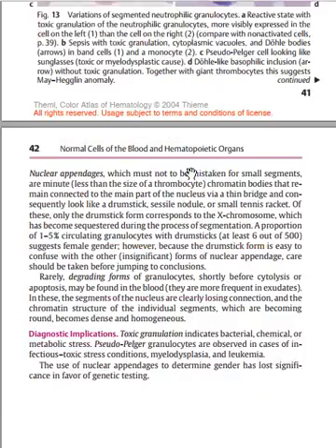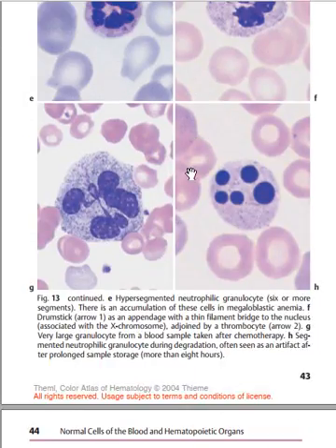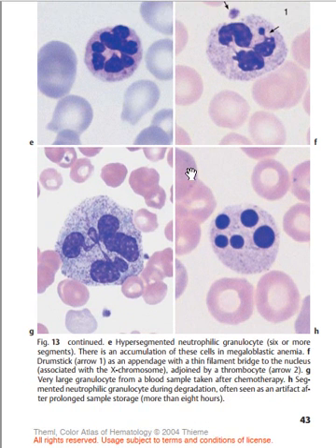Is it clear? Now in this next diagram, we are going to visualize still the clinical correlations of neutrophils. Here you're going to see hypersegmented neutrophils. Is it clear? It has 6 or more segments. So it can be seen in megaloblastic anemia. This hypersegmented neutrophil can be visualized in megaloblastic anemia.